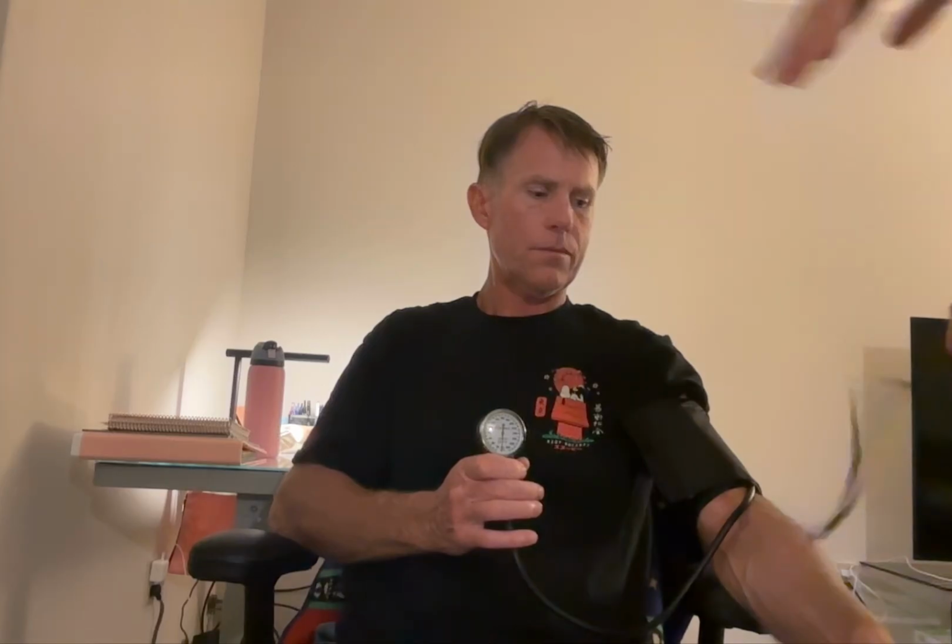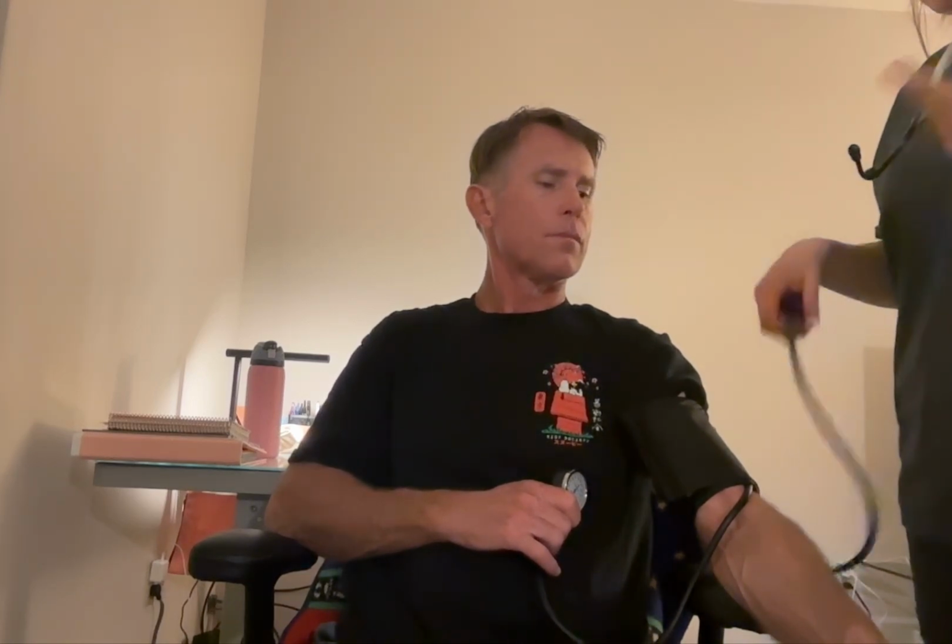Okay, sir, your blood pressure is 110/70. As I heard that diastolic number of 70, I let it deflate an additional 20 millimeters to make sure I didn't hear anything else. So that is within a normal range of an adult blood pressure.